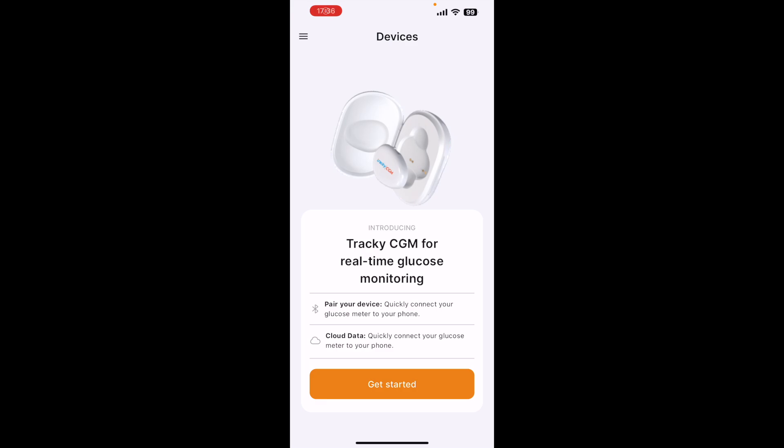Here's how I got to this screen on my Tracky Health app. Download the app from the App Store or the Play Store, then allow Bluetooth and notification permissions. Choose new account and verify your mobile with an OTP. Fill in your profile with all the details they ask for, set your time and range, and also allow location access. That's it, and then you land on this screen.